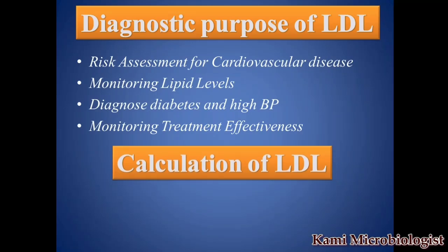Now let's see the calculation of the LDL test. Remember guys, if we talk about how to perform that test, normally in many laboratories the LDL test cannot be performed directly. It can be calculated by a formula. Or in some advanced laboratories it can be done by an advanced machine like Selectra, or other types of fully automated machines. But in most laboratories it is calculated by a formula.